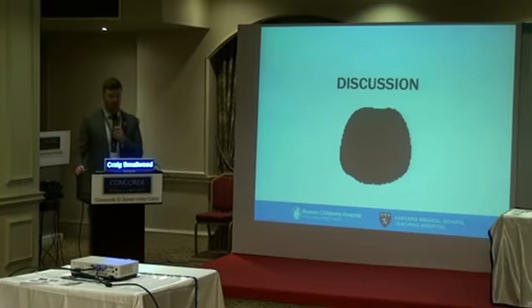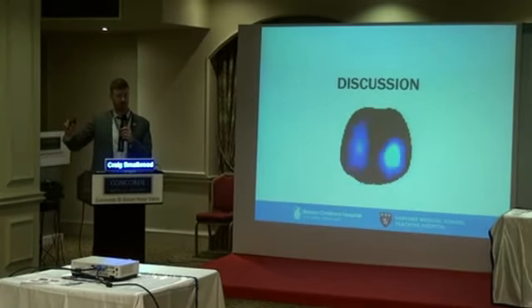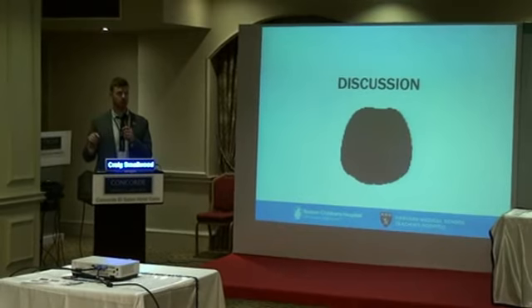Yeah, so one of the things that we have done in our lab, and people have shown in the literature, is simultaneously record ventilator data and EIT images at the exact same time. What you can do is then take that tidal volume and divide it across the image. Or even compliance, that's probably one step better, so we look at regional compliance. And what we've demonstrated in a couple of publications is that the overall compliance of a subject is on the order of 0.5 mL per kilo per centimeter of water.